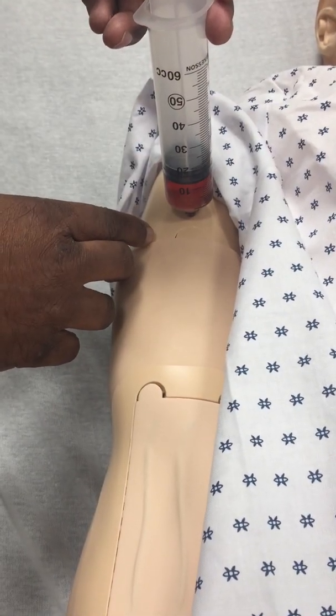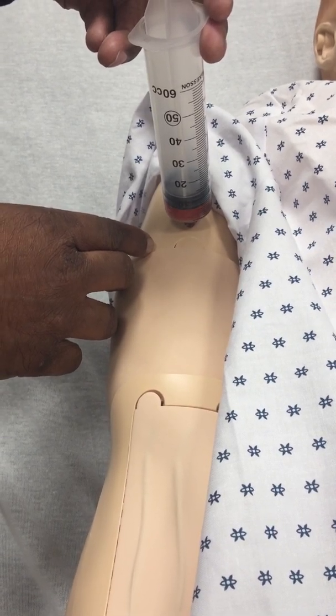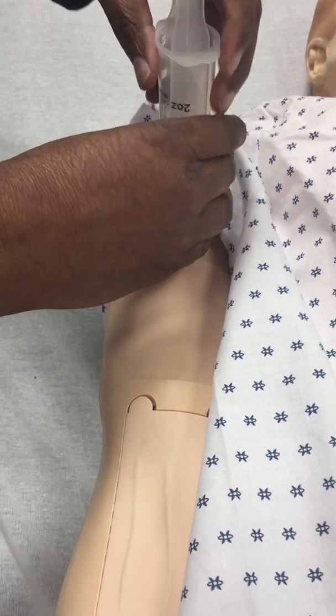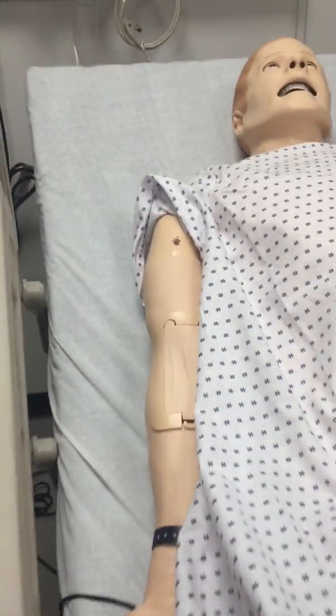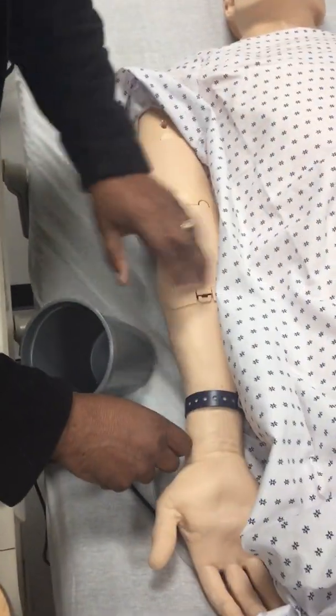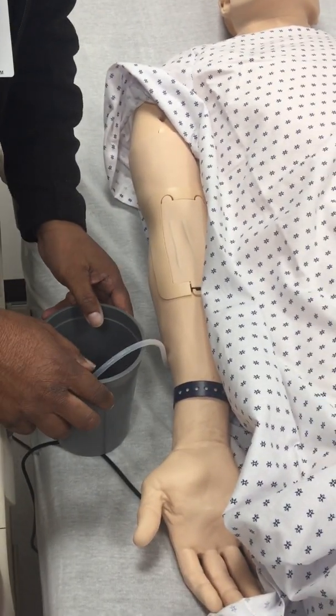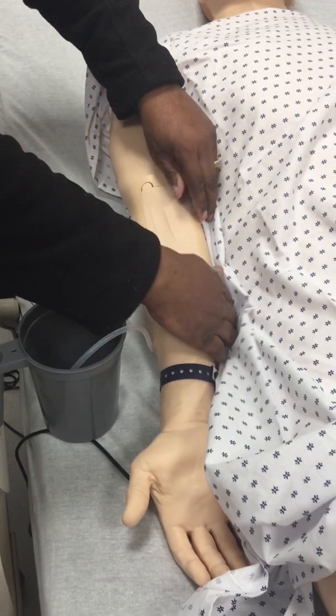We're going to do it slowly. Another thing I'm going to also do — I need something for drainage, because this will leak out. So under his arm, this is the drainage tube. I'm just going to put this ice holder on this water container here.